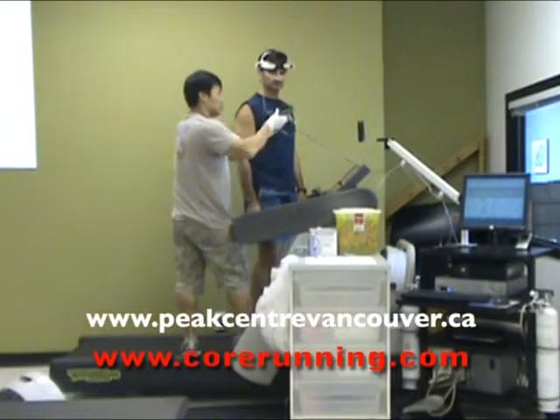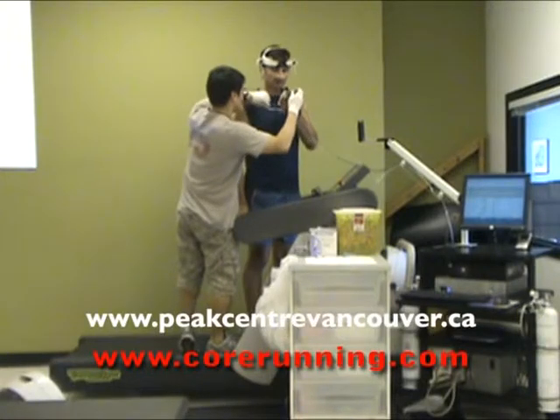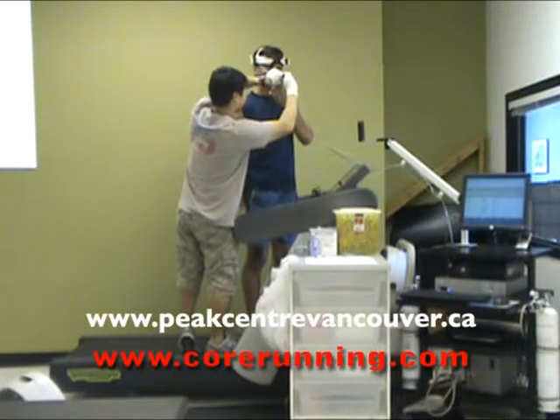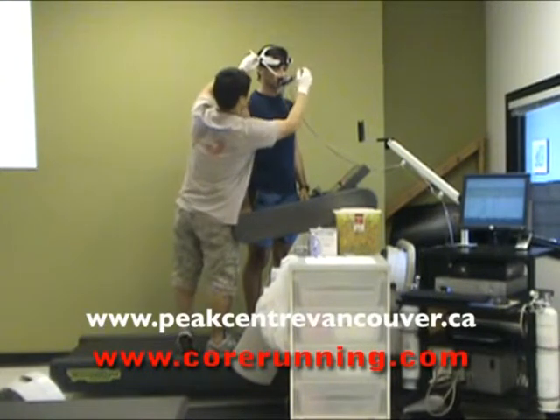This is the mouthpiece — it's a diving mouthpiece. You just put your teeth on it here and keep a good seal around the mouth. That's good, it's somewhat comfortable. You're going to drill like crazy, so just don't let it go.